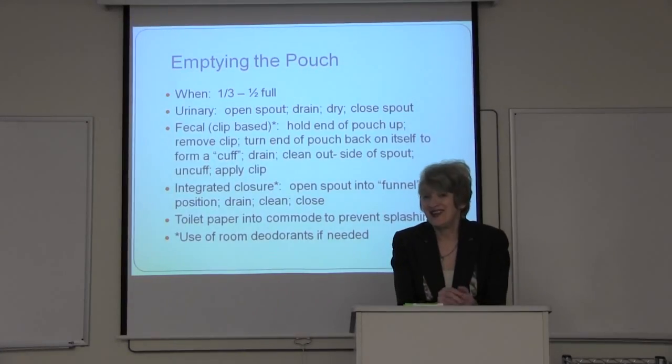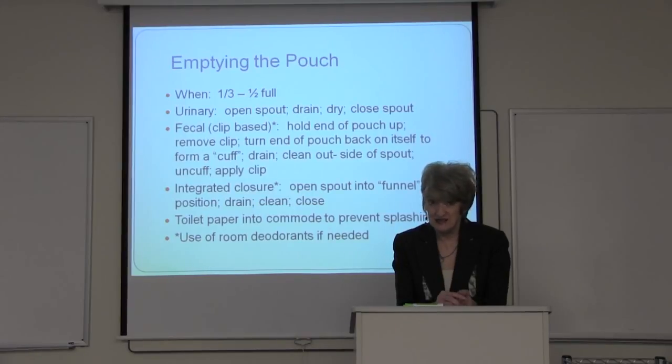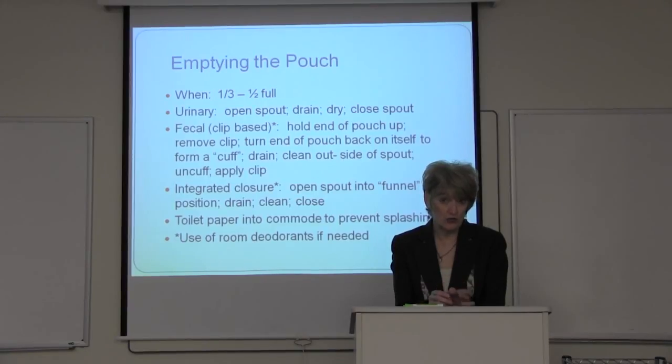Now notice I did not talk about rinsing the pouch. Rinsing the pouch is not necessary, and we don't encourage it on a routine basis because it adds time, adds complexity, adds mess. If it's important to a patient to rinse, I will teach them how to rinse, but I will emphasize to them that they need to use cool water, because warm water will compromise the odor-proof feature of the pouch by dilating the pores in the plastic material.